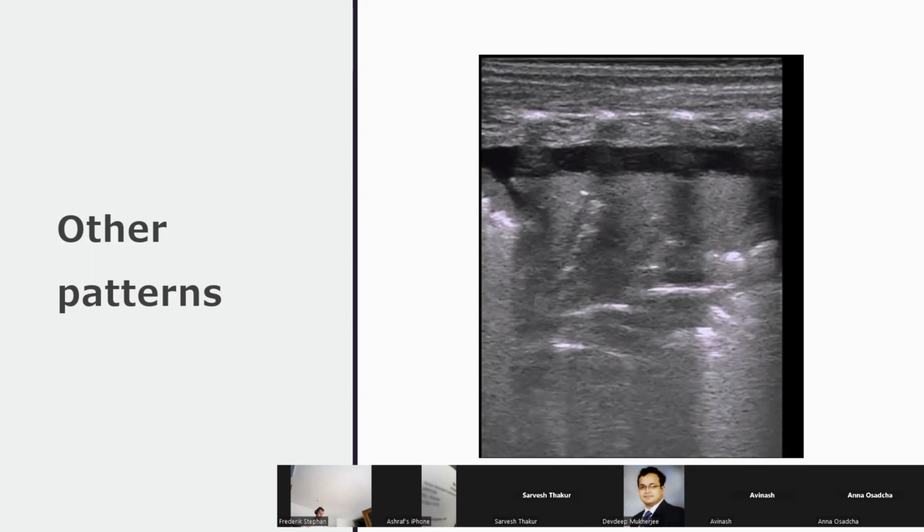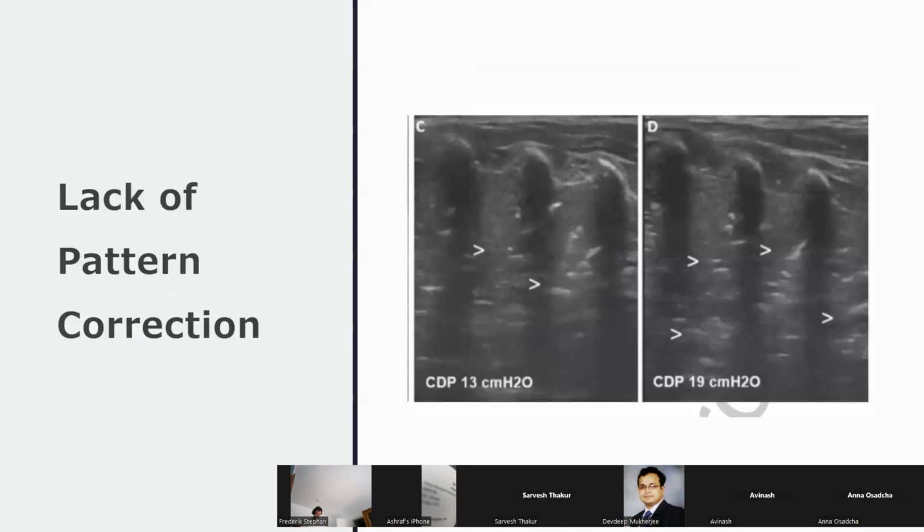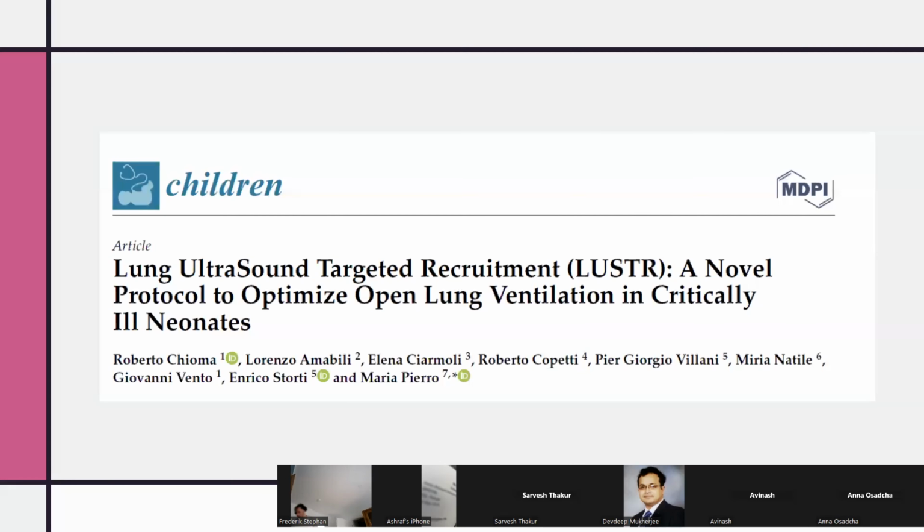Really all of it depends on, again, a comprehensive lung ultrasound. I'd be doing every area, trying to come to a mental model of what I think the primary problem is over here. The options remain postural drainage. The other option remains a recruitment maneuver. The third option, if it's a massive effusion, not that I can see in this particular picture, is whether you tap. And really, that's where I would say that recruitment maneuvers practiced in isolation, you really need to have holistic assessment. Clinical correlation is really, really important.